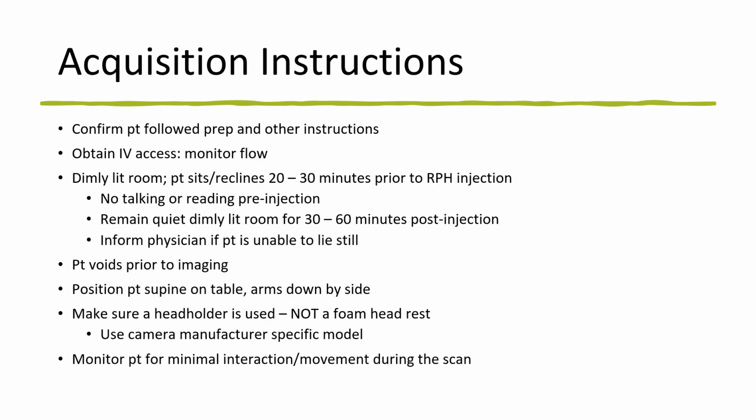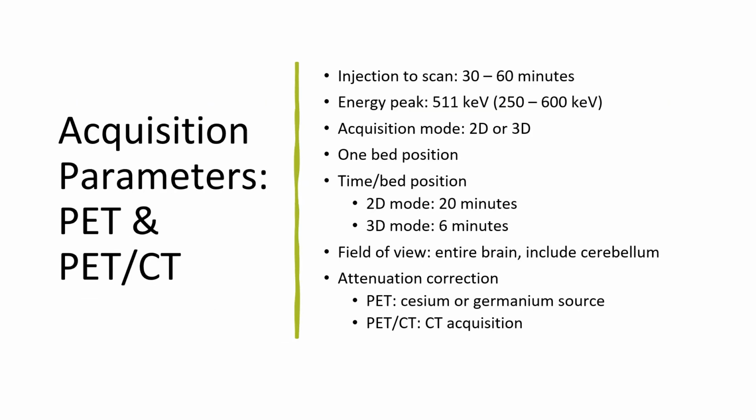You can also lightly put a Velcro strap or something around the patient's head, very loosely, just to remind them to hold still for the images. And you want to monitor the patient for movement during the scan, but you don't really want to interact with them a whole lot during their uptake phase.